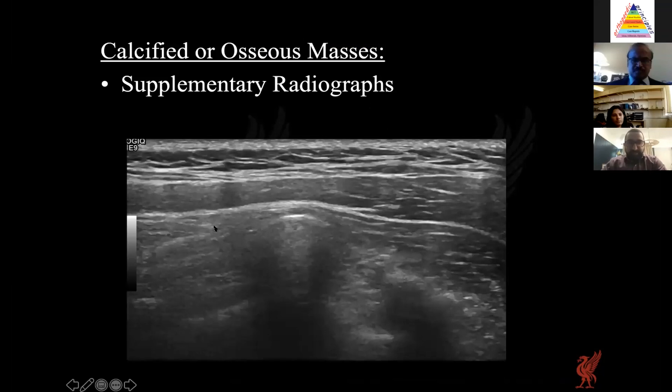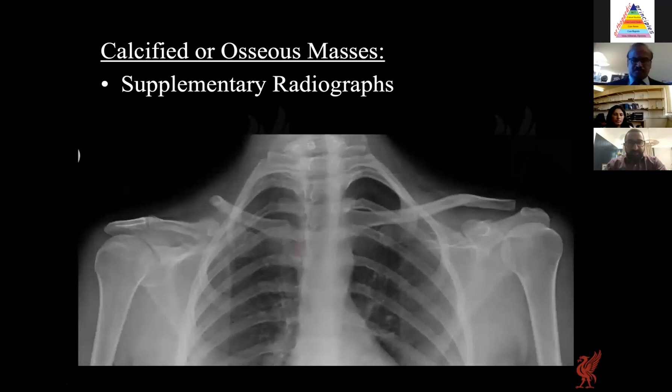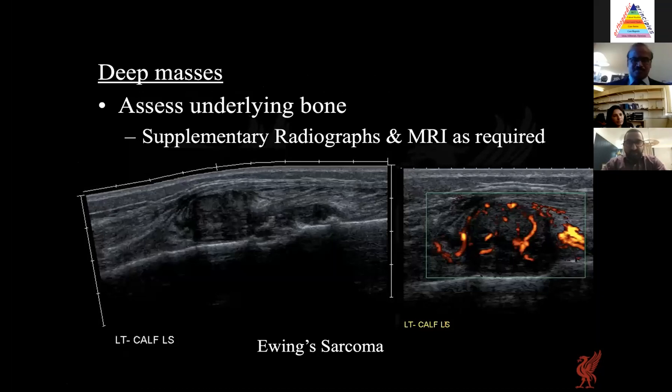In one case, there was a mass showing a very well-defined border, but behind it the lesion couldn't really be assessed. It was only when reviewing the radiological packet, history, or organising a radiograph that the diagnosis became quite obvious — the supraclavicular mass was actually the palpable end of a clavicular fracture. So for deep masses, you may need to supplement the ultrasound examination with radiographs or MRI.